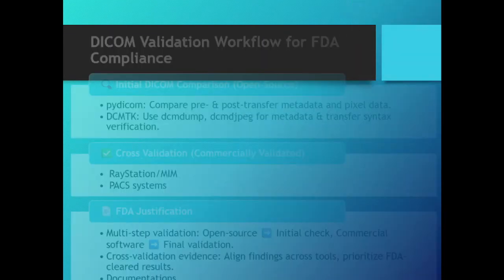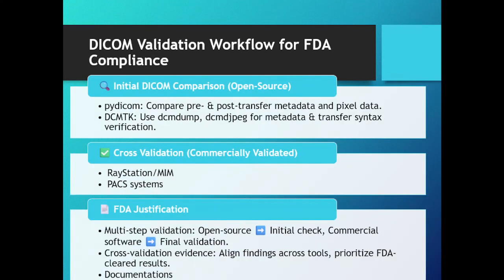So next, I want to talk a little bit about the FDA insights if we want to validate this DICOM tool. Because DCMTK is an open source toolkit, and PyDICOM is also open source, the way I compare is not enough if we want to prove it for FDA submission.